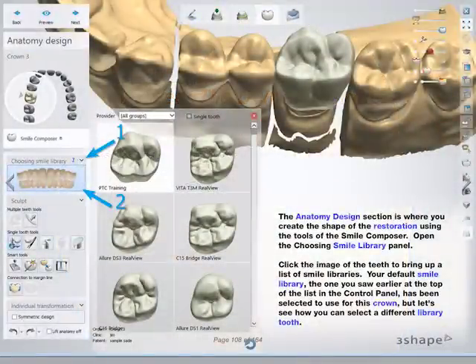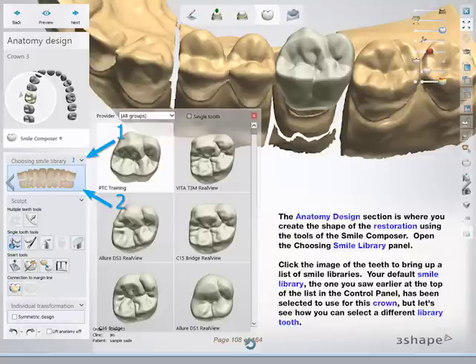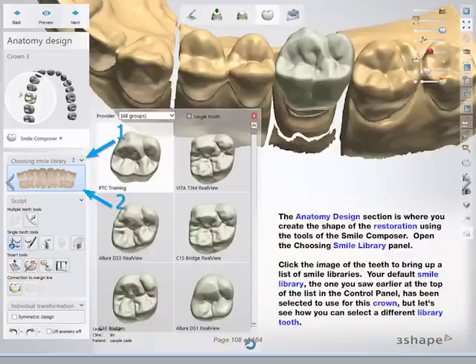The Anatomy Design section is where you create the shape of the restoration using the tools of the Smile Composer. Open the Choosing Smile Library panel and click the image of the teeth to bring up a list of smile libraries. Your default smile library — the one you saw earlier at the top of the list in the control panel — has been selected for this crown. But let's see how you can select a different library tooth.